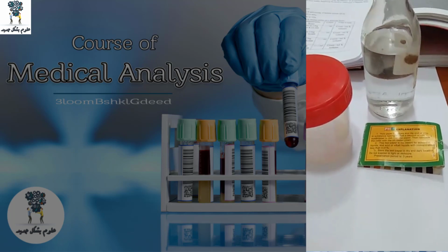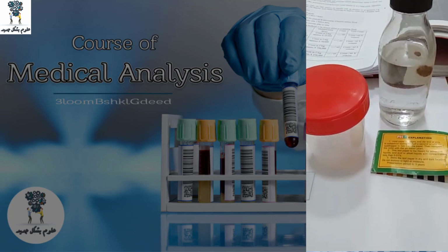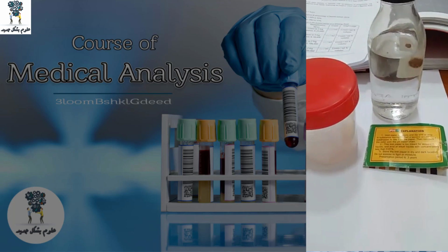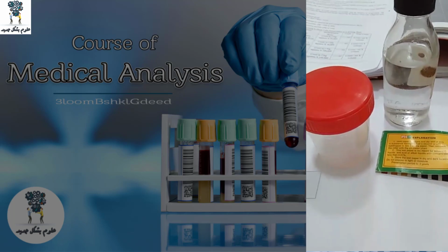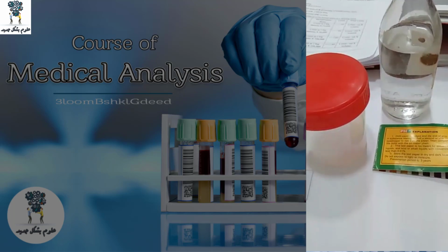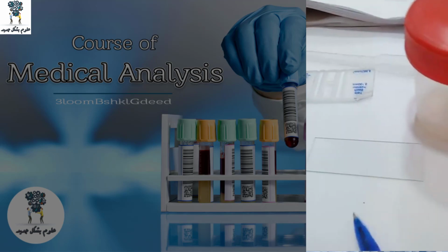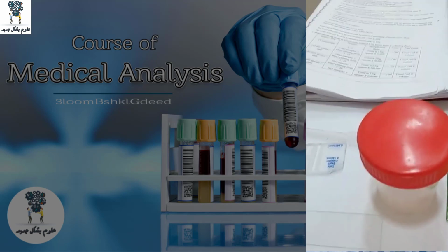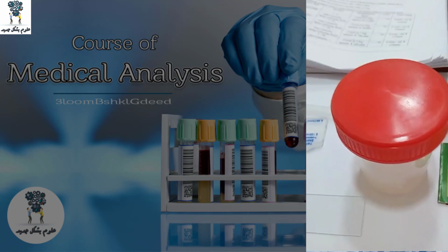We will check vitality to ensure that the sperm are alive and have movement. In this case, it is important to test vitality by using eosine dye. What is another thing that we will look at under the microscope on this slide? We will first find the sperm, whether there are sperm or not.